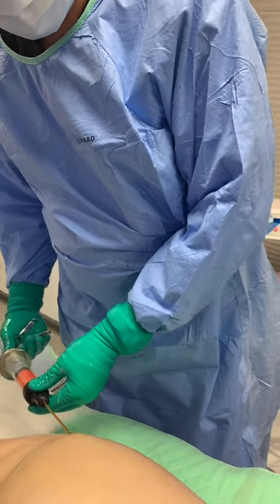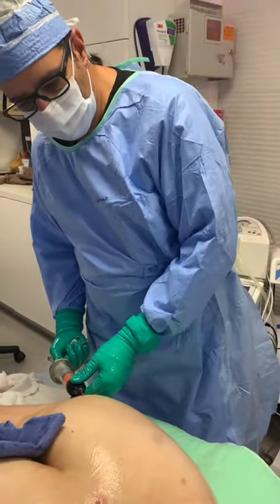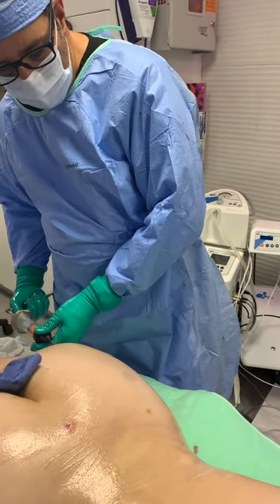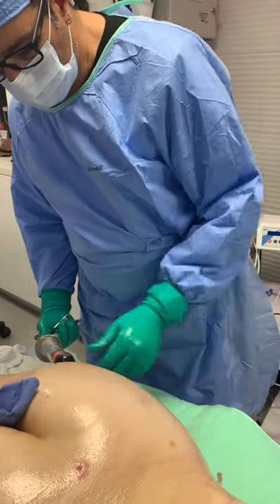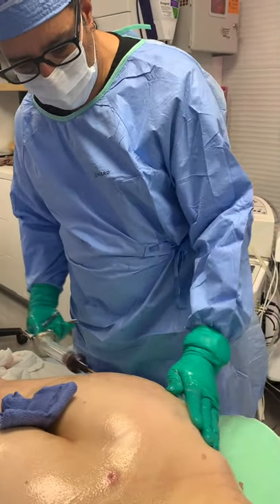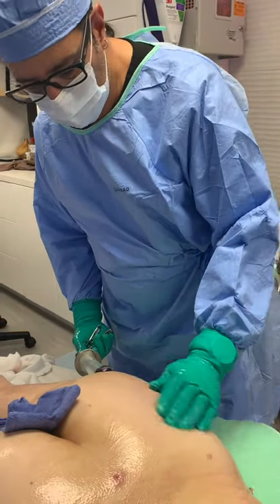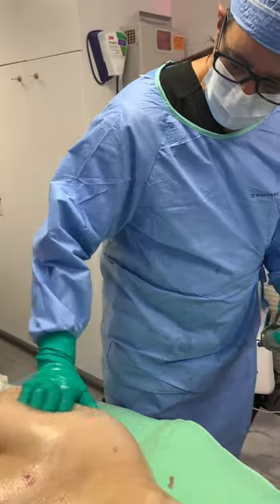Definitely has a little bite to it, but she's got nitrous oxide. And I have numbed her up pretty decently, but it still has a bite to it. All right, first syringe, off side.